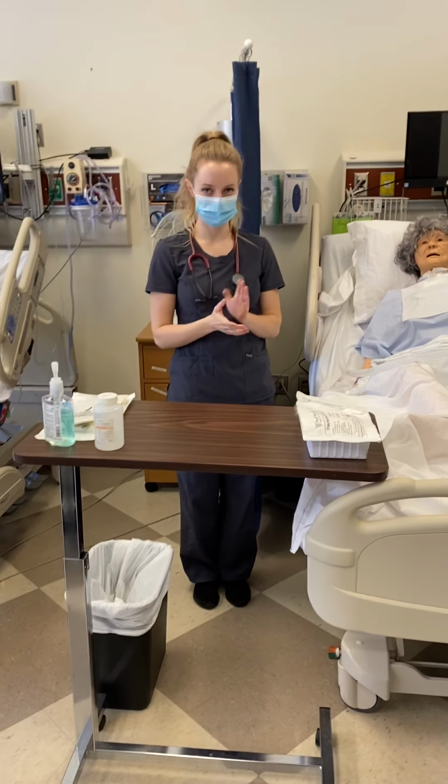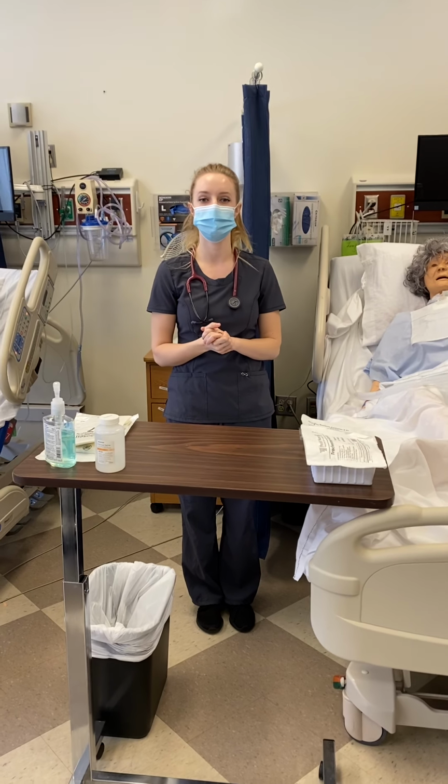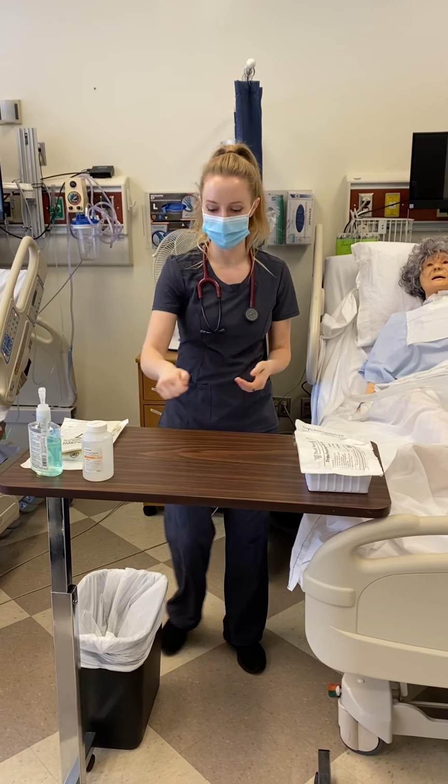Hi, my name is Grace Reese. I am an 8th semester nursing student at Lincoln, and today I will be demonstrating different types of suctioning and tracheostomy care.